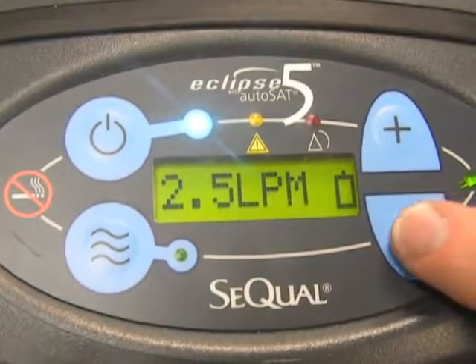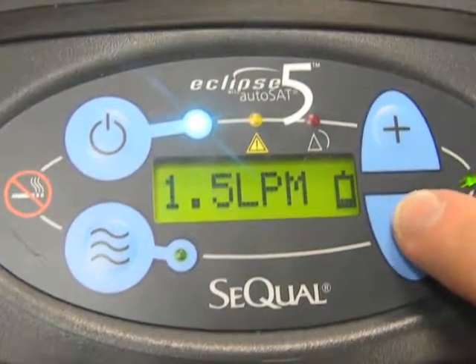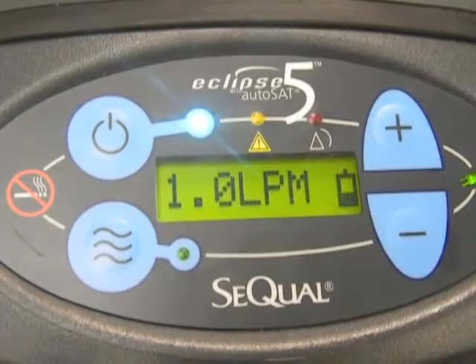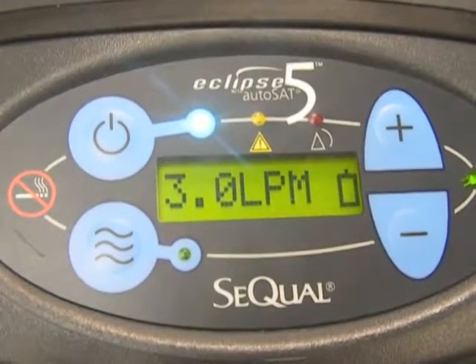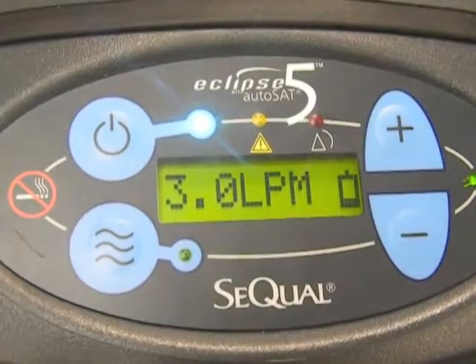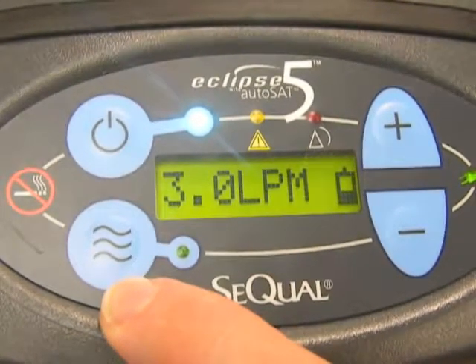So if I wanted to go down to 1 liter per minute, I would press the down button until it reads 1.0 liters per minute. If I wanted to go to 3, I would press the up button to get to 3 liters per minute. And again, this is all continuous flow. To switch to pulse flow on the Eclipse, you press this button here with the three wavy lines.